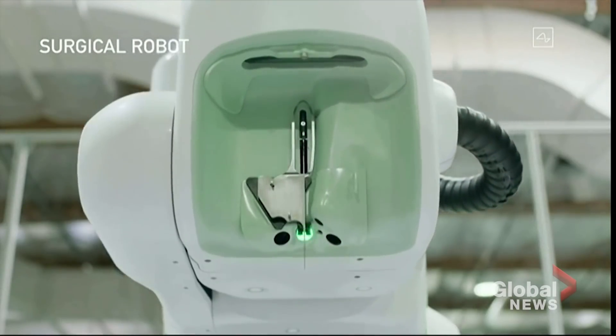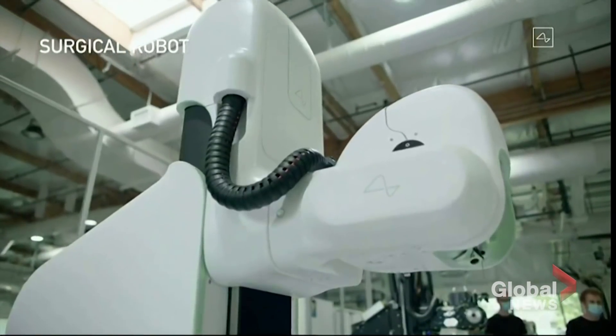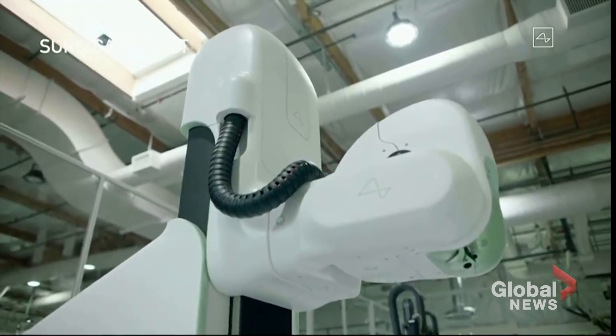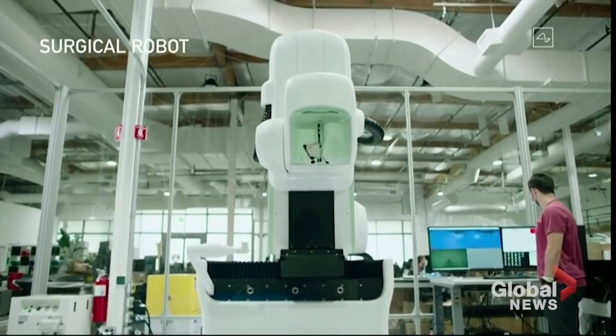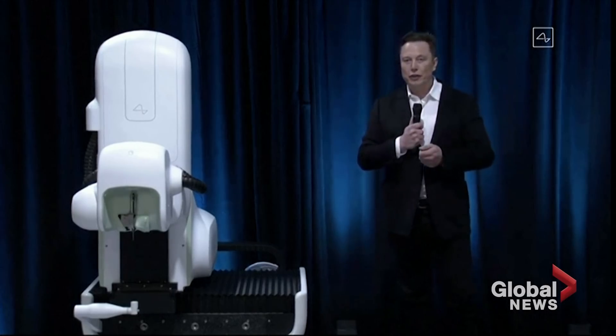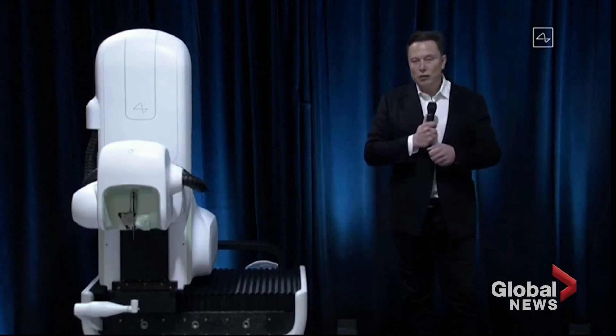We ultimately want this robot to do essentially the entire surgery — everything from incision, removing the skull, inserting the electrodes. We feel confident about getting the link procedure, the installation of a link, done in under an hour. So you can basically go in in the morning and leave the hospital in the afternoon.